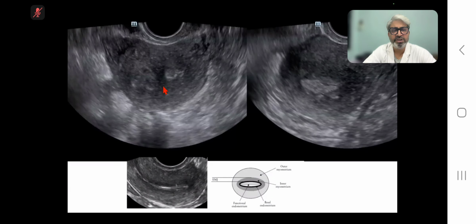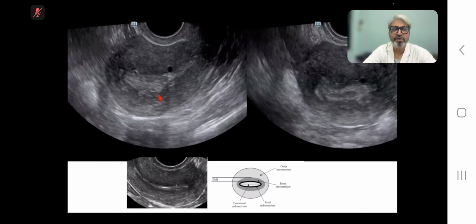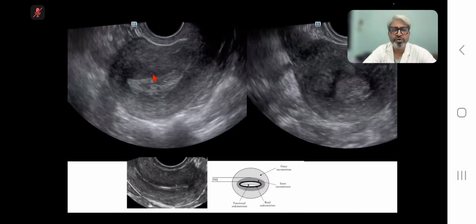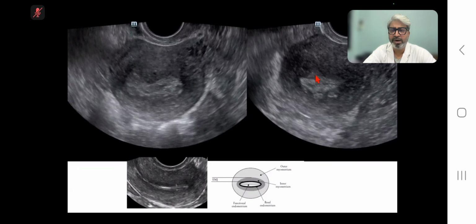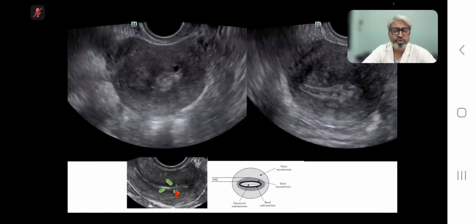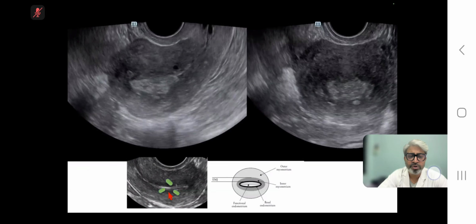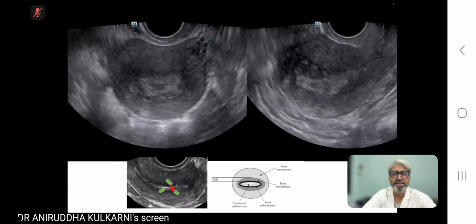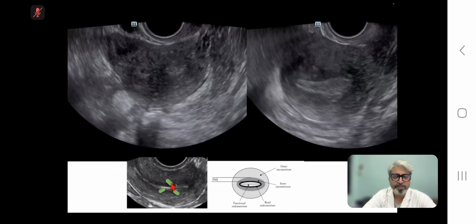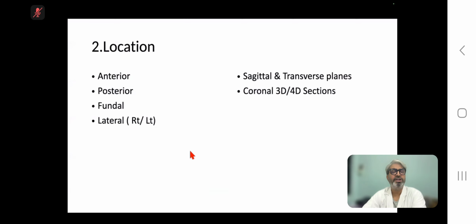They are hyperechoic, echogenic strands, presence of islands, as well as strands arising from the endomyometrial junction. And I can also demonstrate tiny cystic spaces adjoining the thickened area of the endomyometrial junction zone. So I always have to be vigilant in looking at the endomyometrial junction zone adjoining the endometrial triple line configuration, which may be thickened, irregular, interrupted, along with the presence of hyperechoic strands, buds, or linear echogenic striations, which could be one of the common hallmark features.